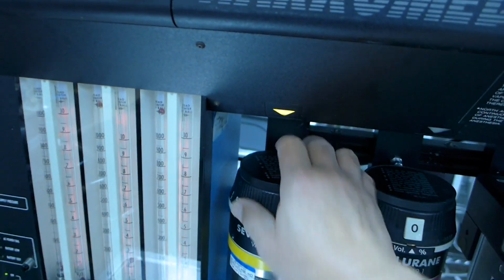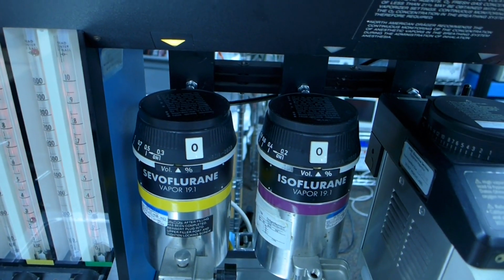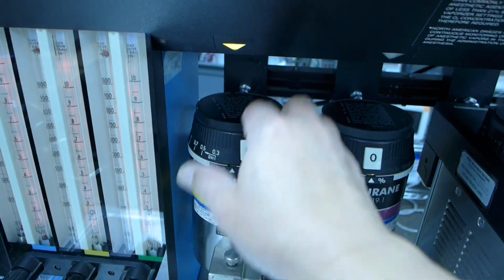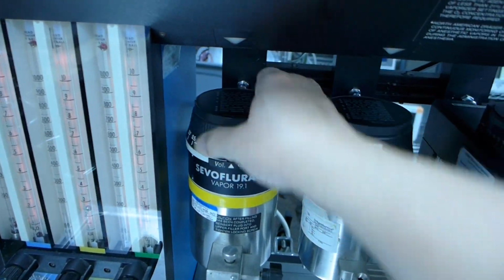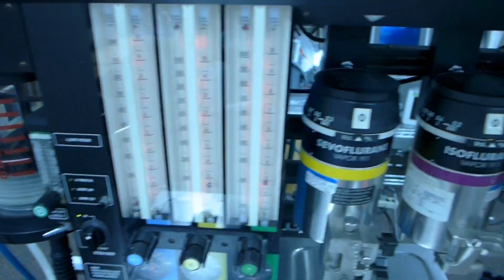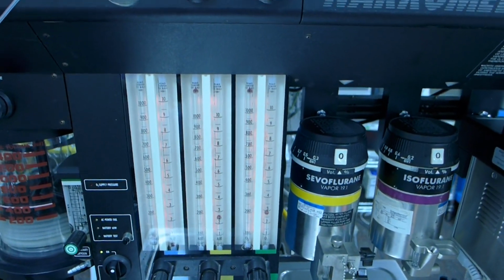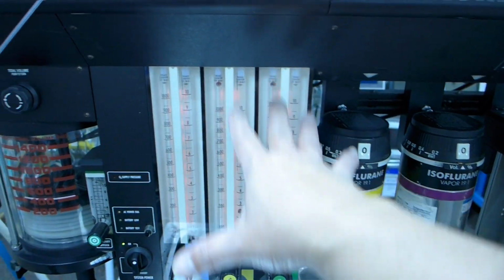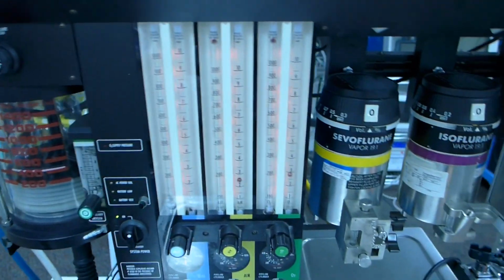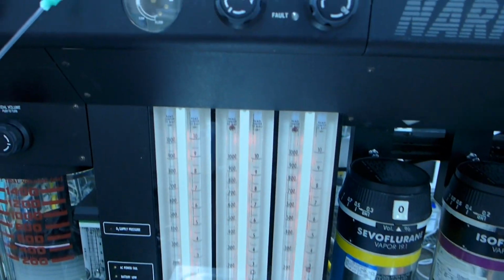The reason they have this light here is that sometimes in the operating room they turn off all the lights, so they make sure they have lights in here. The same thing in here, you can see there's a light in the background. So basically, when the lights in the operating room are turned off, you can actually see the flow of the gas.